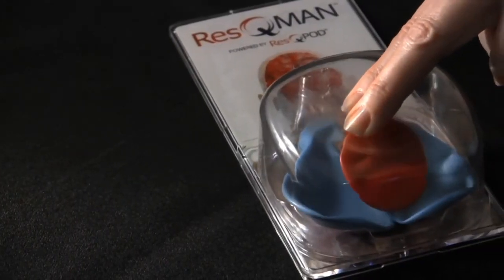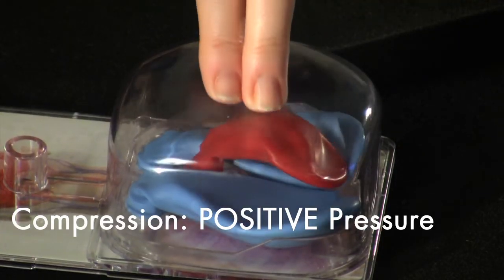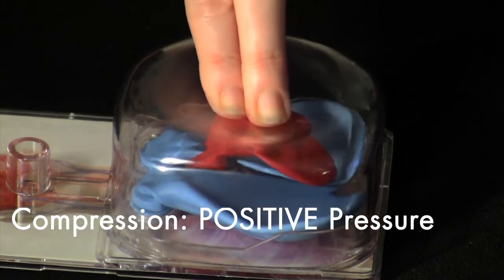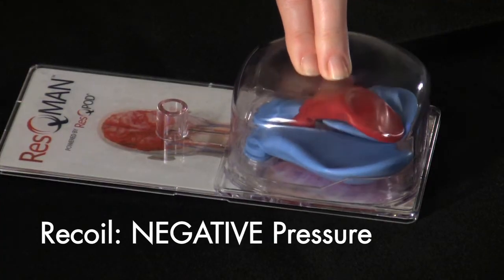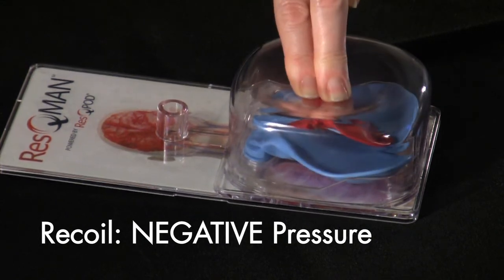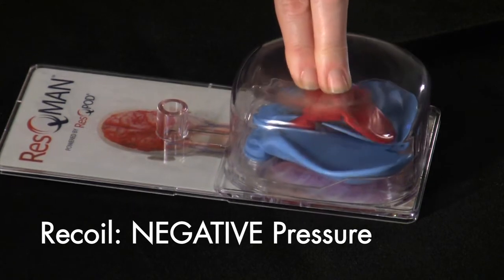Each time we compress, we create a positive pressure inside the chest that pushes blood out of the heart and air out of the lungs. During decompression, the chest wall recoils and creates a vacuum that pulls some blood back into the heart and some air back into the lungs.